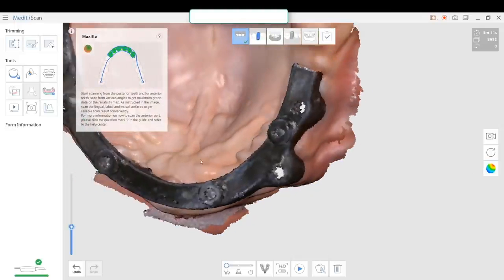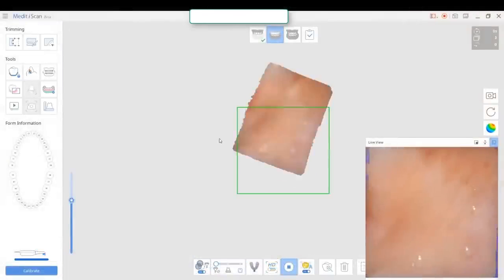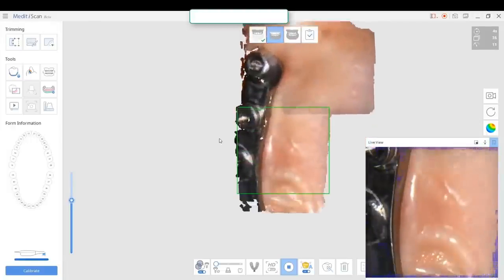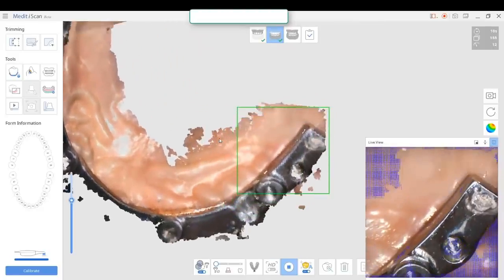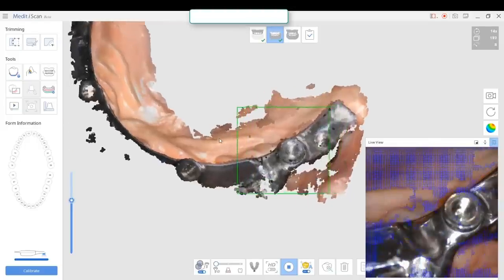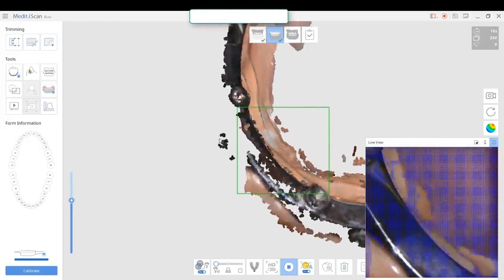And here's the soft tissue model when you come out of the reliability map. And there's the feature that is meant for highly reflective metal scanning. And this video is not forwarded at all. You can see the time it takes up in this top right corner. That was 10 seconds to go from one side of the arch to the other. But again, if you're inexperienced, don't be misled.